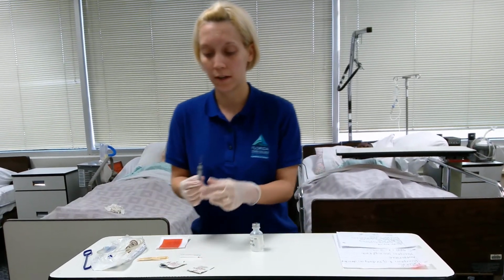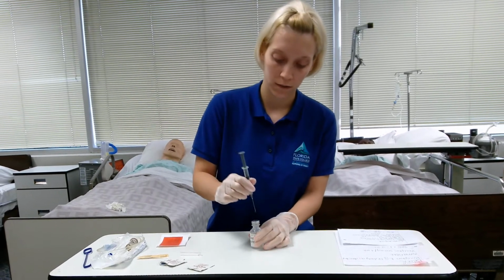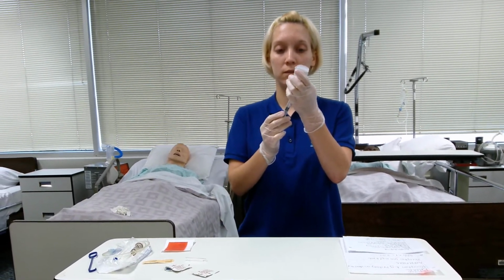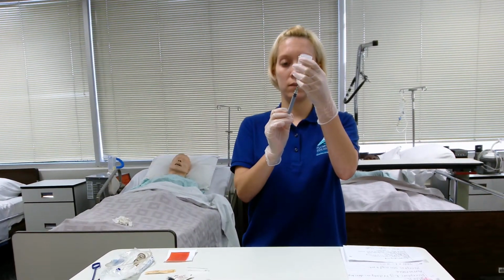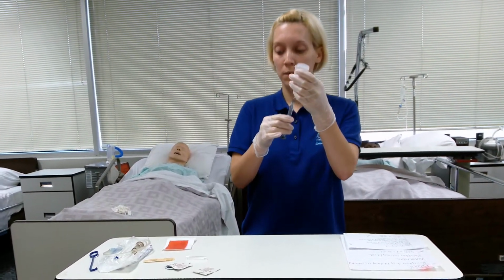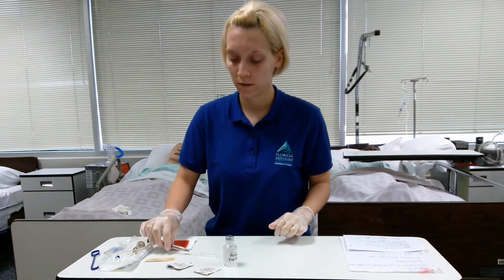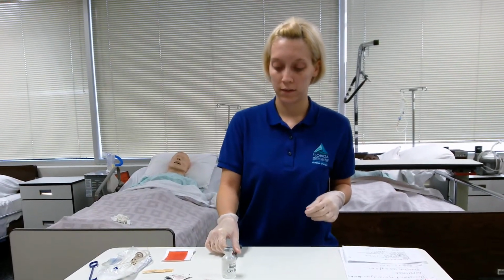I'm going to draw up air. Scoop method. Okay.